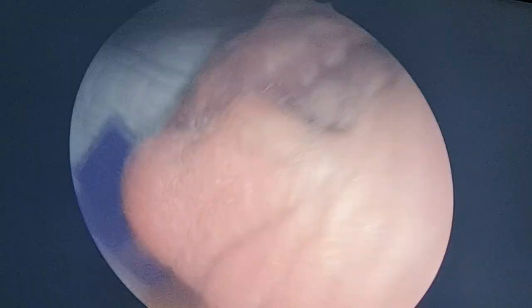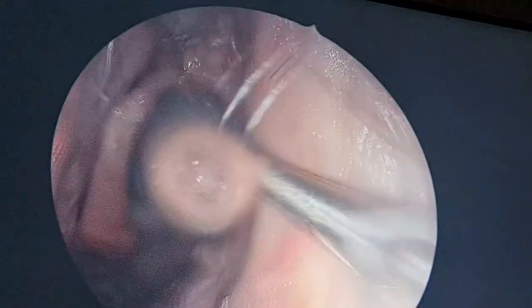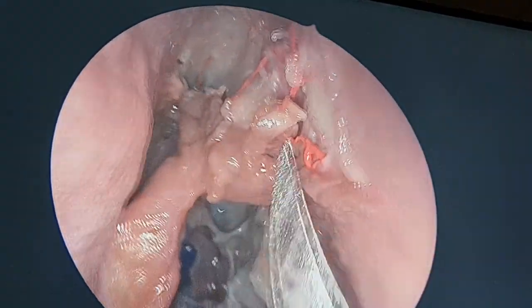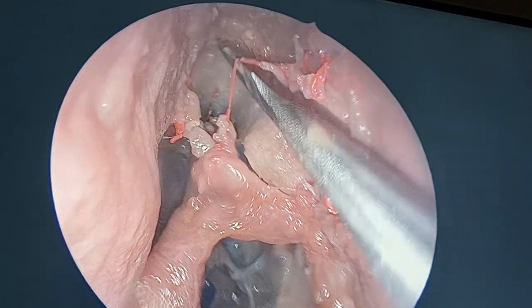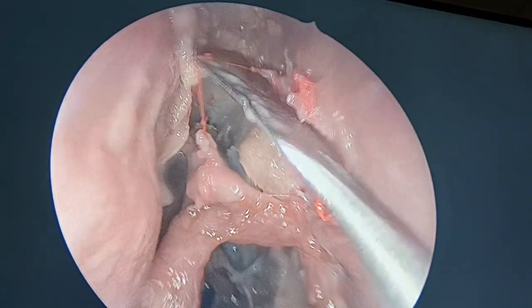Why modified endoscopic Lothrop? The same procedure Lothrop described open, wherein he removed the entire floor of the frontal sinus bilaterally, including the intersinus septum and the upper part of the septum, by an open approach. That Lothrop described in 1914. This was revised by Draf, everything done from inside, that is endoscopic modified Lothrop, that is Draf 3. So these are the standard procedures, there are various modifications. So let's do the Draf 2 and then you get on to your dissection work. And then we'll show you on every table how you can extend your modifications of the Draf.